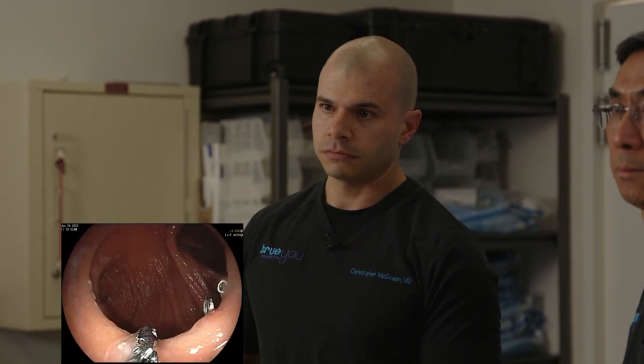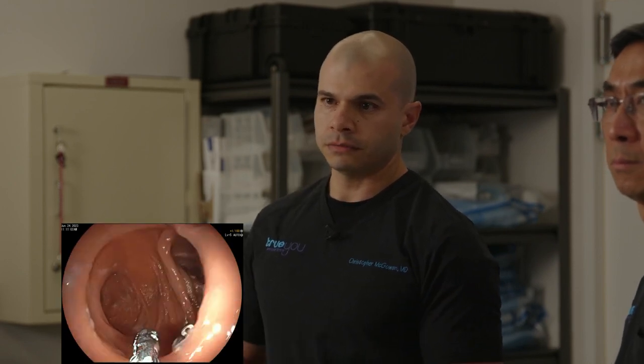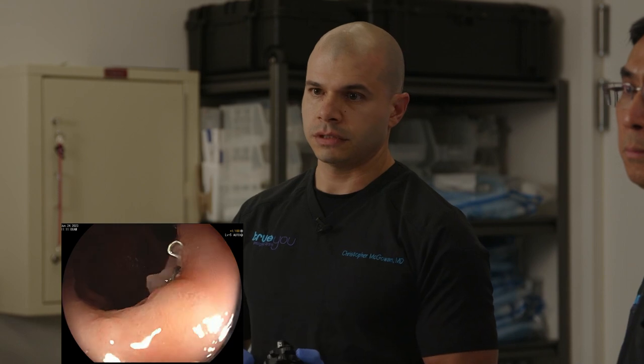So we're using just a grasping forceps. Go ahead and open and close. Open. And the reason I want to remove these is just because they could become a problem. Go ahead and close down the line. Open. I'm going to try to get the angle on this. I think right there, close. So, all right, open.